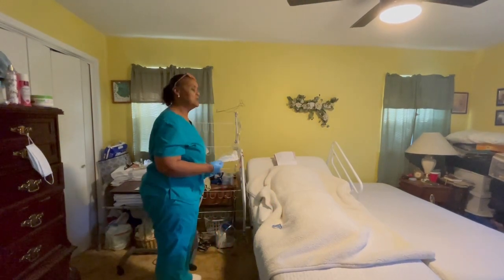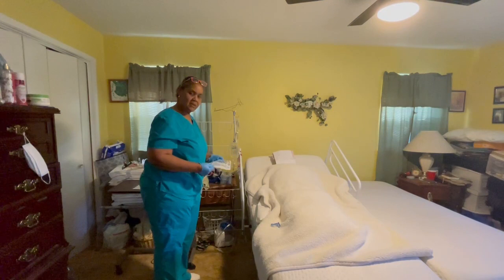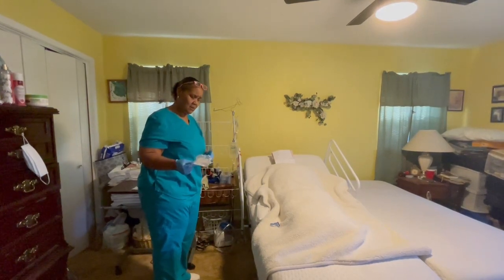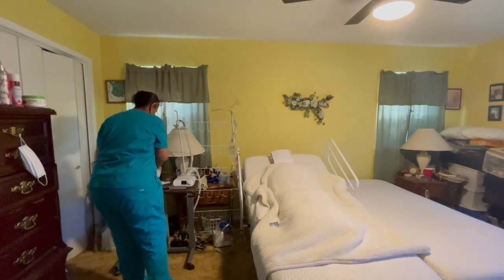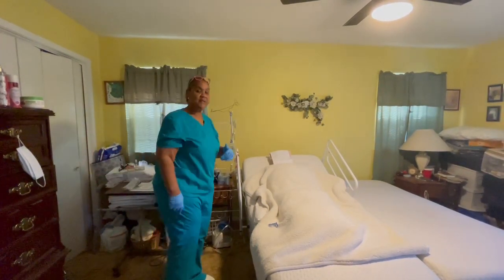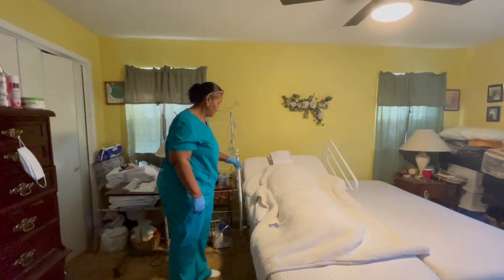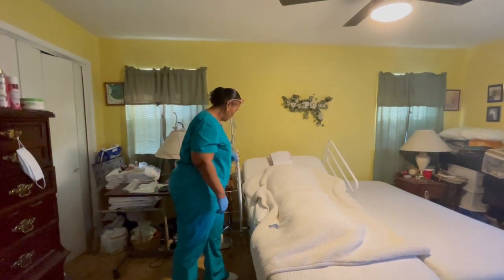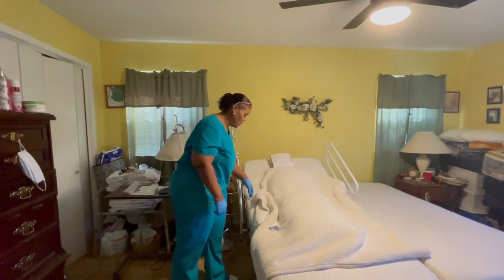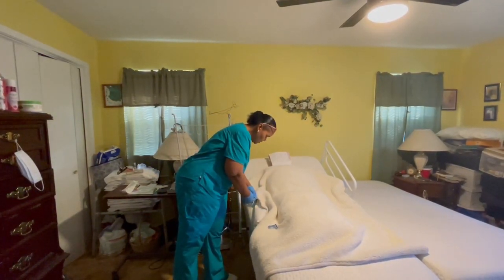You let your patient know that you'll be back to check on them. Ask them if they're okay. They say yes, everything's fine. You'll come back in 30 minutes. Once you come back and the IV is finished, you're going to turn off your pump. Once you turn off your pump, you're going to clamp it. You're going to close your clamp. Then you're going to undo your secondary.